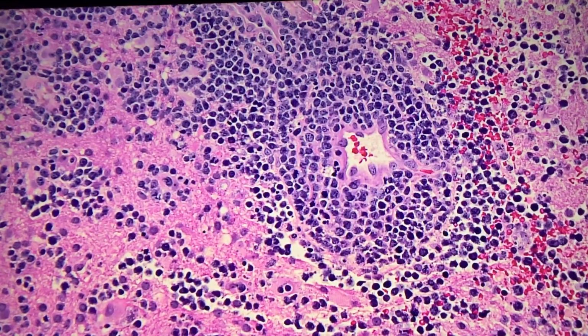Are they usually primary CNS lymphomas, or are they usually brain involvement from a systemic lymphoma? Actually, they're usually primary CNS lymphomas, and the absence of a systemic lymphoma is how you can suggest that this is a primary CNS lymphoma. In this particular case, this patient has a systemic non-Hodgkin lymphoma, so this is secondary involvement of the brain by a systemic lymphoma.